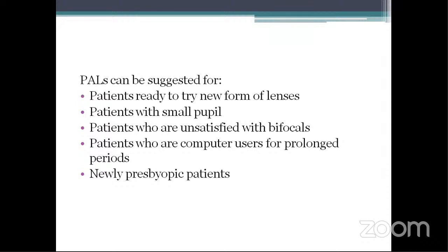PALs can also be suggested for patients who are ready to try a new form of lenses, patients with small pupil, patients who are unsatisfied with bifocals, and patients who are computer users for prolonged periods because they need intermediate vision. Because of the computer distance, this is an intermediate distance for newly presbyopic patients.